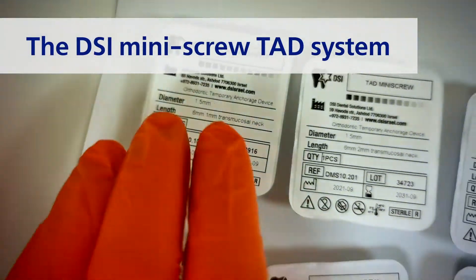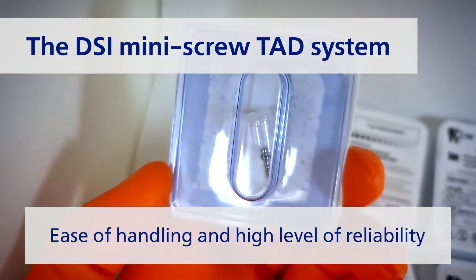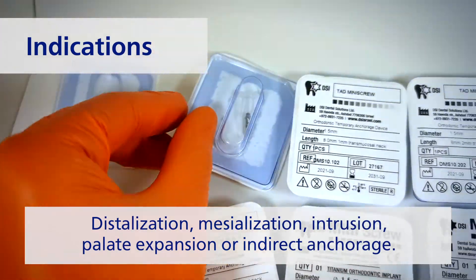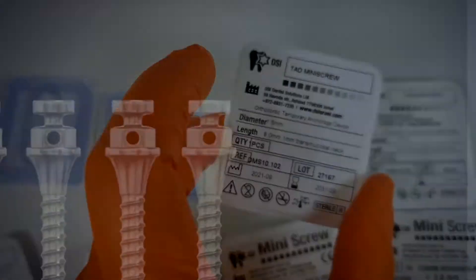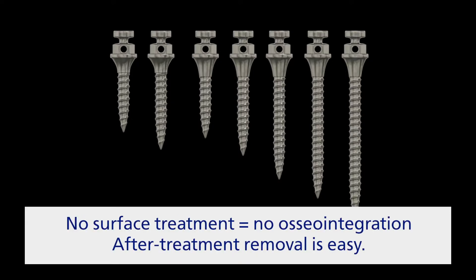Products are produced using the same materials and methods as our full-scale dental implants. Let's take a closer look. The DSI mini screw TADS system convinces users thanks to its easy handling and high level of reliability. The complete system covers all indications: distalization, mesialization, intrusion, palatal expansion, or direct anchorage. A choice of grade 5 titanium makes it very strong, biocompatible.